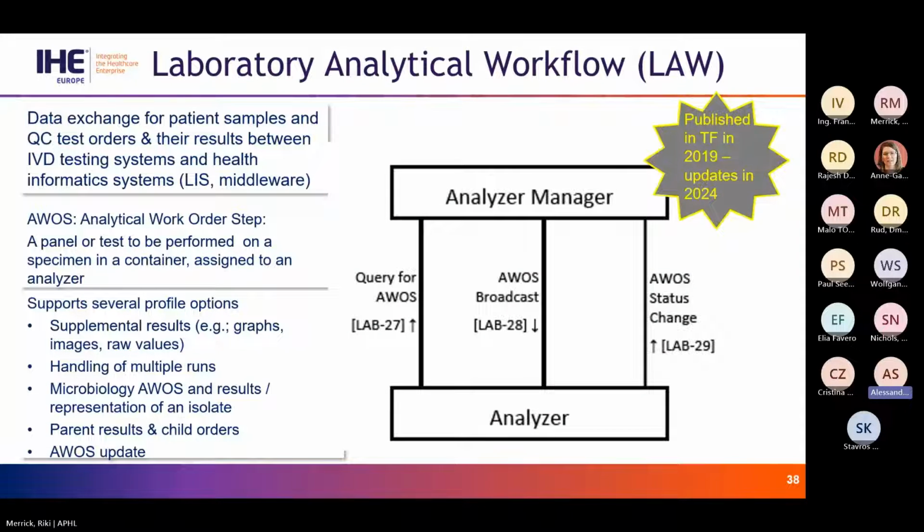The second key profile, as I said, is the laboratory analytical workflow, which in relation to the previous diagram of the laboratory testing workflow involves the part where the analyzer manager is, we can say, the connector between the laboratory testing workflow and this profile.